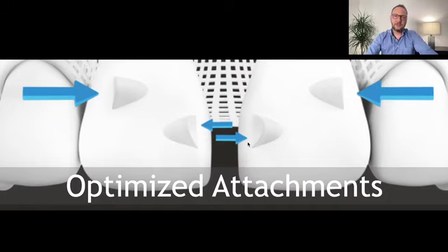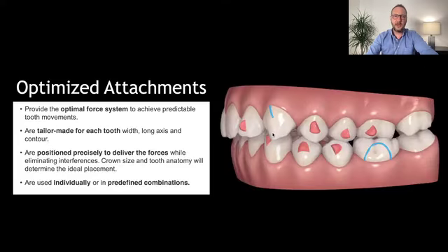You can ask to include them, but when it comes with optimized attachments, we need to evaluate if it is worth it to keep them or if we need to change. This is a very clinical evaluation, and we need to understand why the optimized attachment is there, okay? So here you can see a case where our attachments are optimized. You can note that each one has a specific shape, okay?